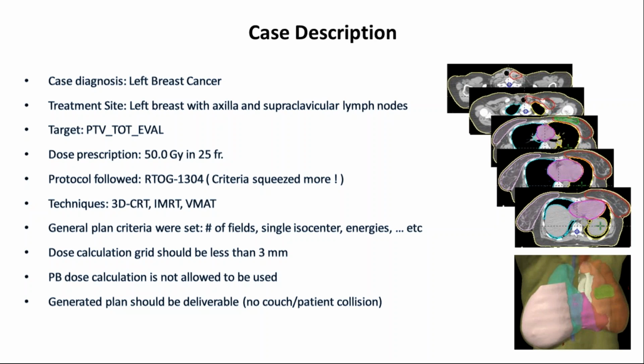So top plans, very high score plans. Some people may say it's not practical, it's very ideal, but when it comes to beam on time, you could reach 3 minutes and 4 minutes. This shows you the importance of planners having the highest skills possible, because two planners are using the same planning system, but one can achieve a very high quality plan, the other cannot.